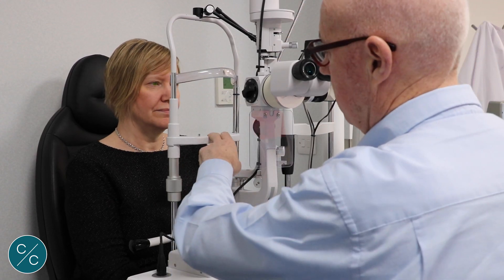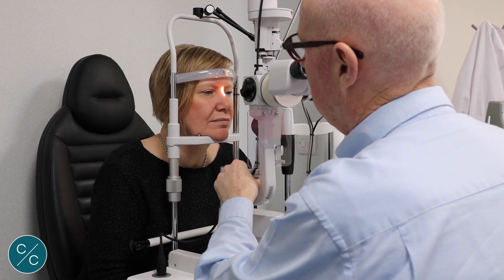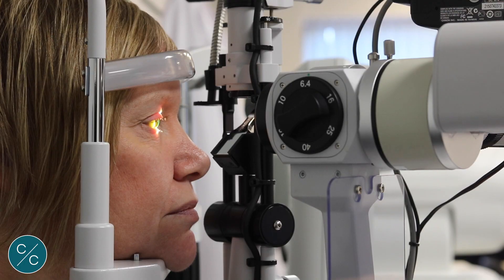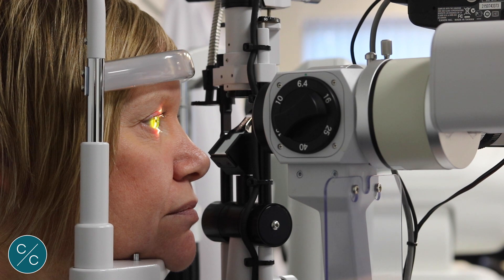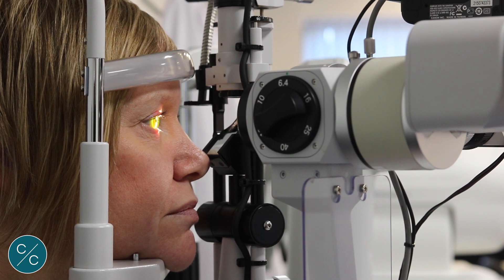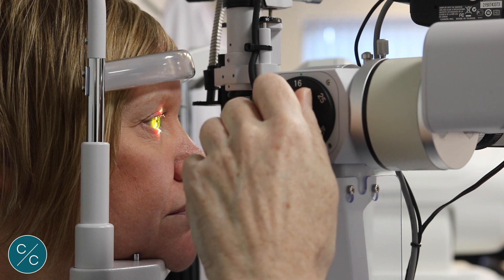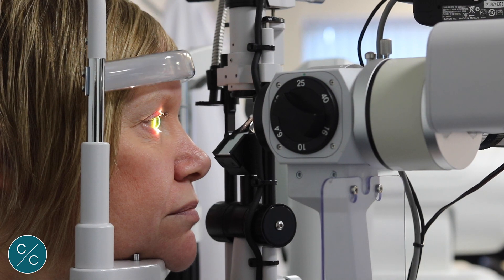Okay, so we'll ask Sue to sit forward, drop your chin down onto the rest, forward against the top rest, move forward and looking straight past me. Just checking that the magnification is on the lowest possible setting, coming in to commence focusing. Having got it in the best possible focus, I can then increase magnification and tune in.